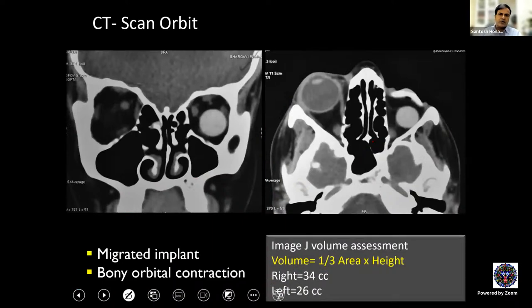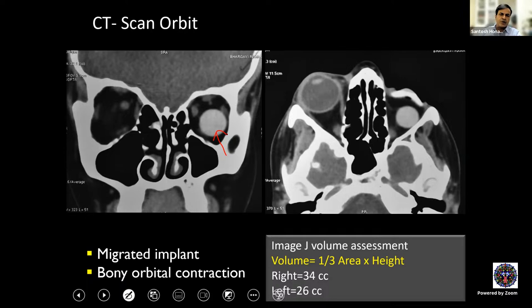Special indications include patients who have an ophthalmic socket. This patient has an orbital implant which is decentered inferiorly on the left side and the patient has a contracted socket — acquired following enucleation where a suboptimally sized implant was placed. Before planning further intervention, you can measure the volume of the orbit on CT scan. Here it is clear that the right orbit measures 34 cc and the left orbit lags behind due to the suboptimally developed orbit from the small and displaced implant.